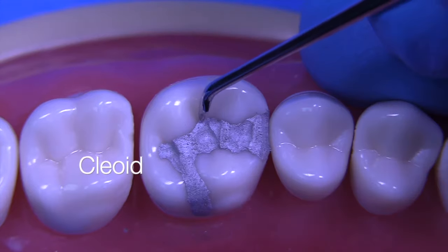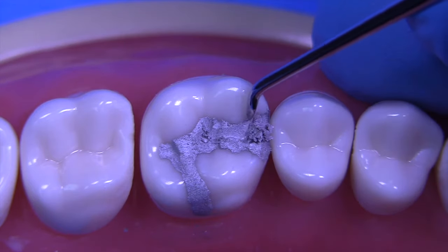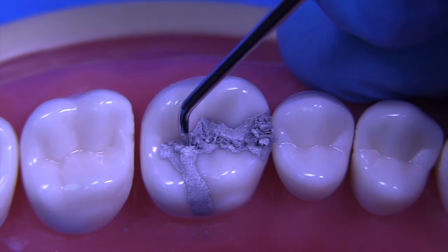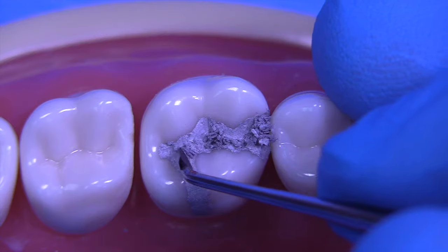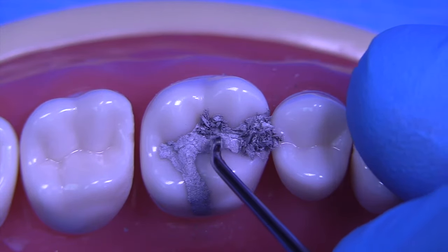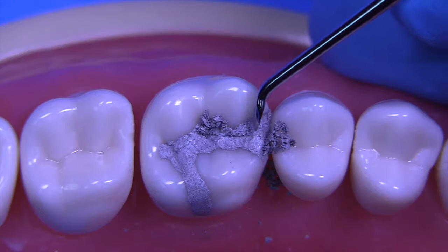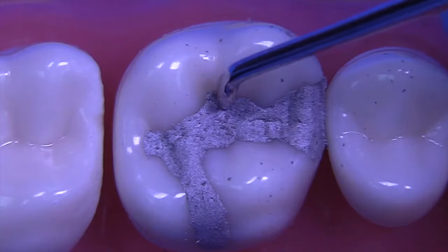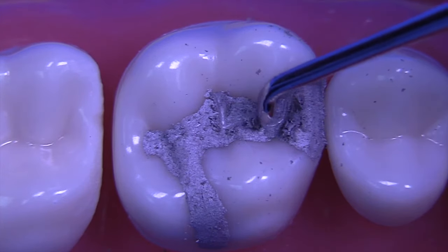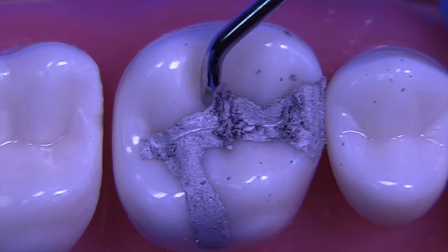We're now going to utilize the cleoid to look for the grooves adjacent to your amalgam and follow them down into the amalgam. Amalgam carving is about creating harmony with the existing tooth structure, all the while making sure you don't ditch the margins. The cleoid is great for finding those grooves and establishing natural contours that flow from one fossa to another. I try to keep the cleoid touching the margin when I'm developing the bulk of the anatomical form. You can pull the cleoid or slide it — that sliding motion down the groove into the central groove can be very effective at developing nice anatomy.